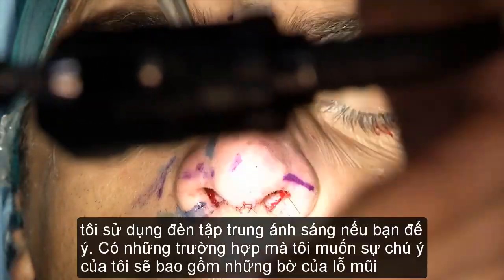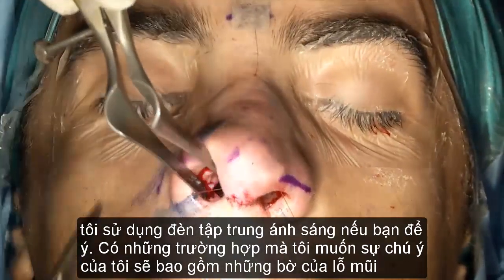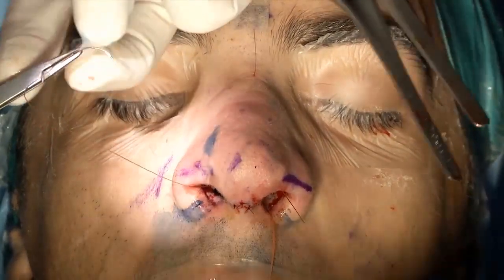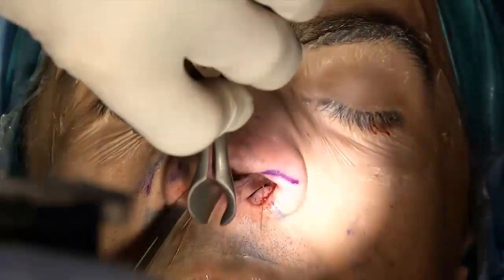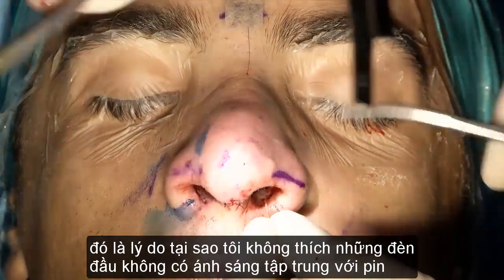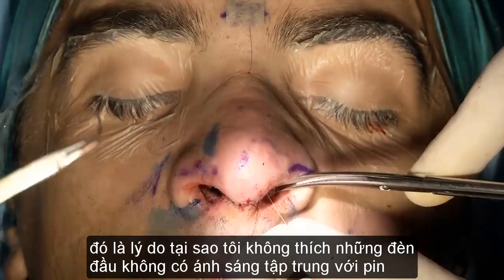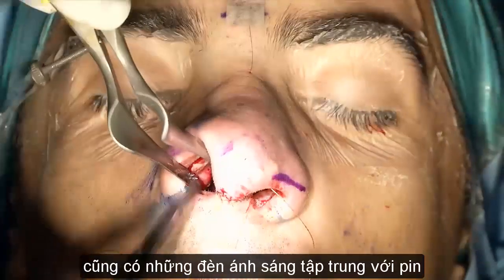Okay? I use a focusable headlight, as you will notice, since in these instances I want my focus to be contained within the boundaries of the nostrils. That's why I don't like non-focusable portable headlights with a battery. Now there's one which is focusable with a battery as well.